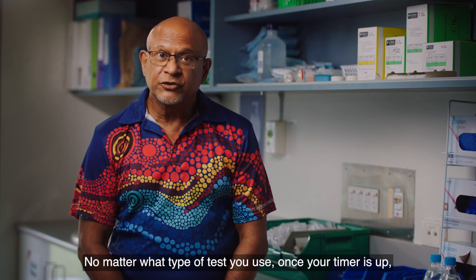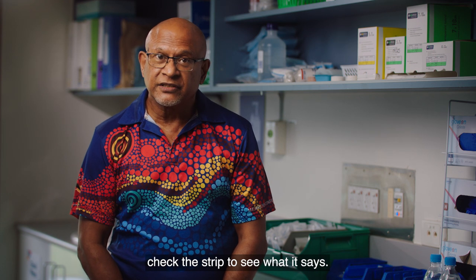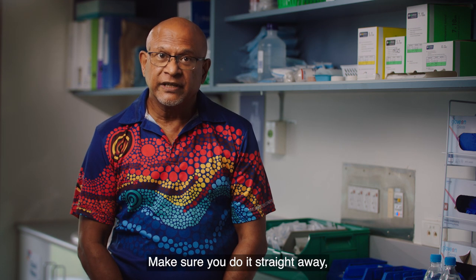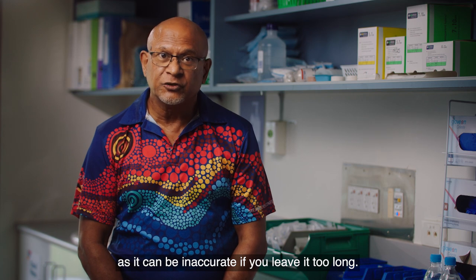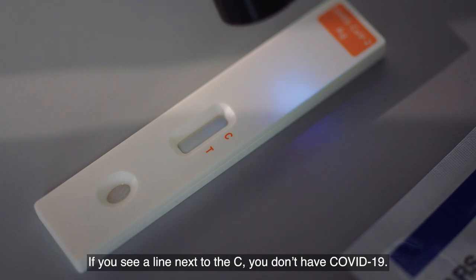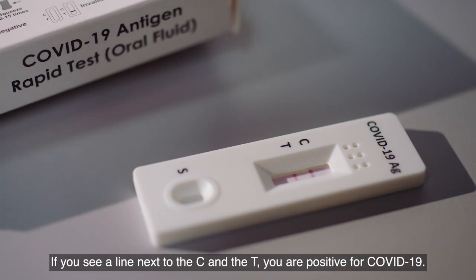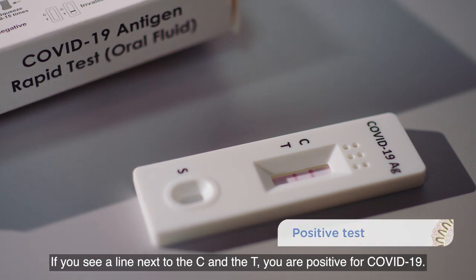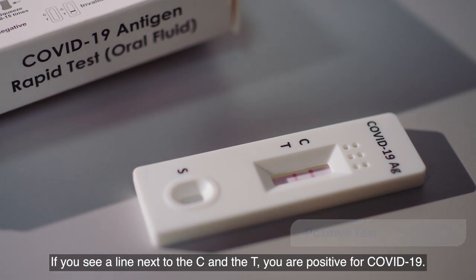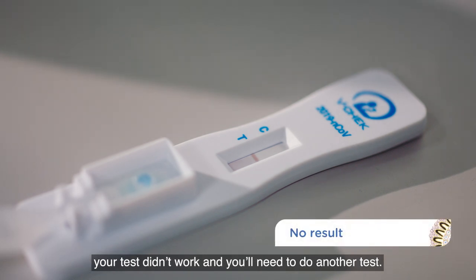No matter what type of test you use, once your timer is up, check the strip to see what it says. Make sure you do it straight away, as it can be inaccurate if you leave it too long. One RAT even has a torch to help you read the strip. If you see a line next to the C, you don't have COVID-19. If you see a line next to the C and the T, you are positive for COVID-19. If you only see one line next to the letter T or no lines at all, your test didn't work and you'll need to do another test.